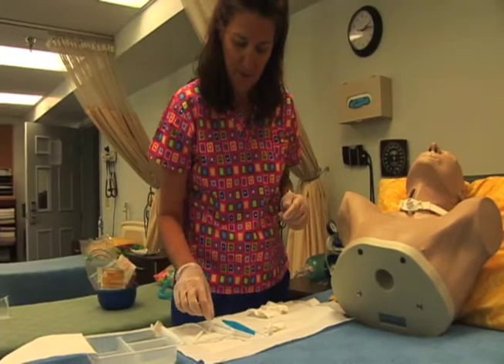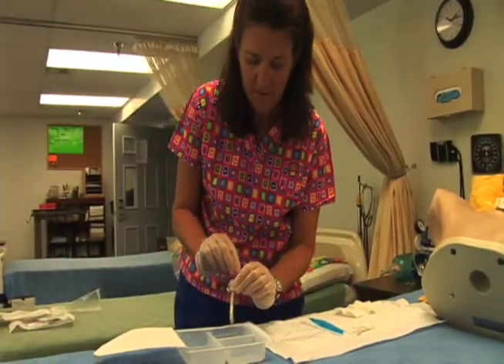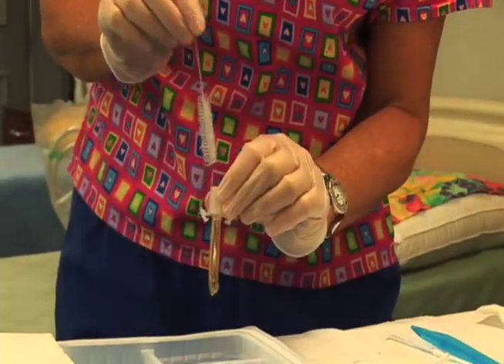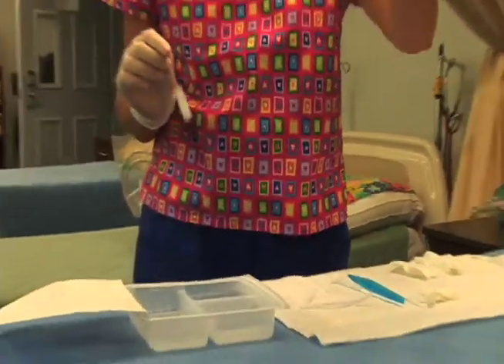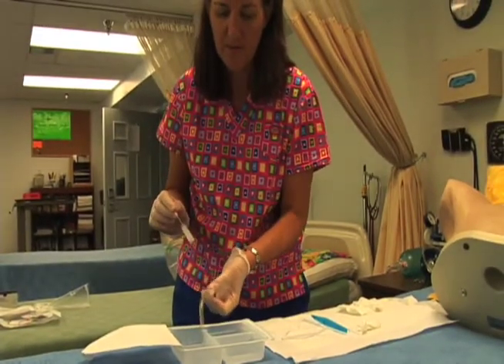Okay, now at this point you will take your brush and you will cleanse out the inside of this really good. And rinse it in your sterile water. You don't want to put it in the patient with water in it, so you want to turn it over and tip it.